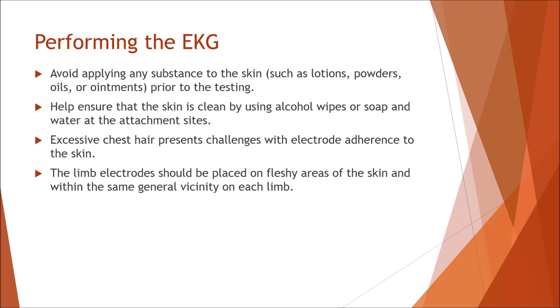Okay, so performing the EKG. Whenever you're going to do the EKG, you want to make sure that the patient is not wearing any sort of substance on them. Okay, and this is lotions, powders, oils. If they are wearing something, you usually want to use alcohol wipes to wipe it down.